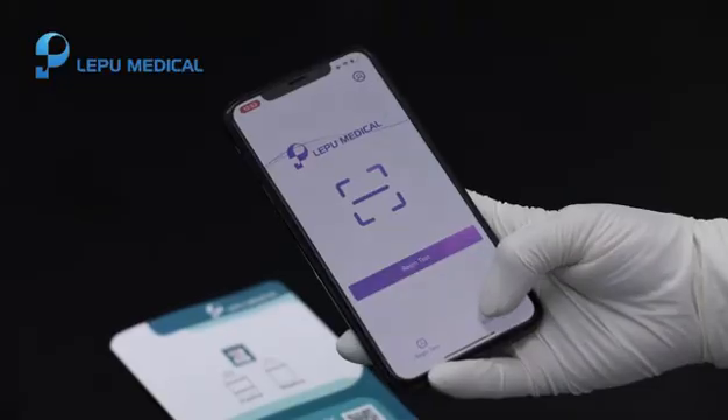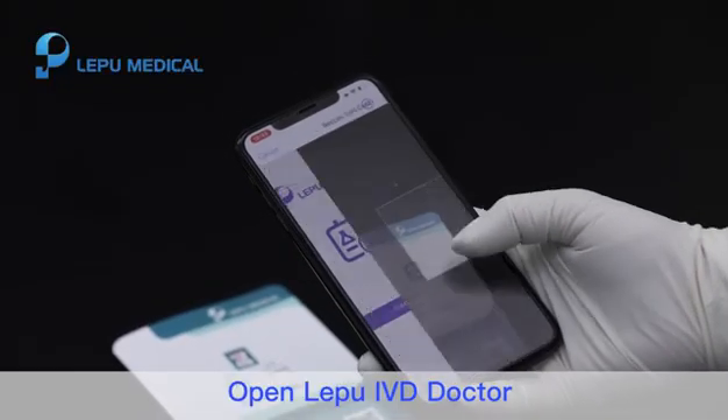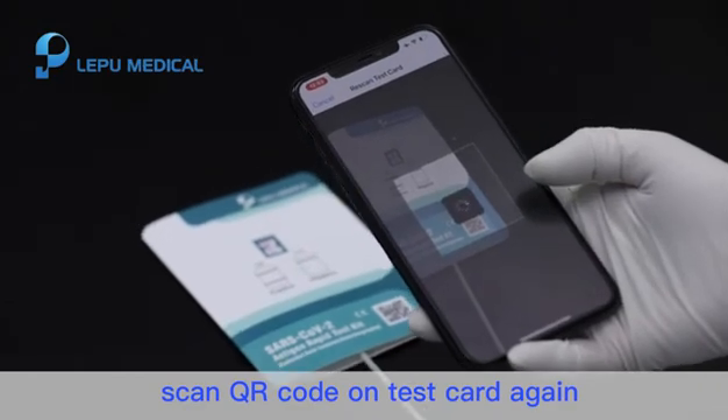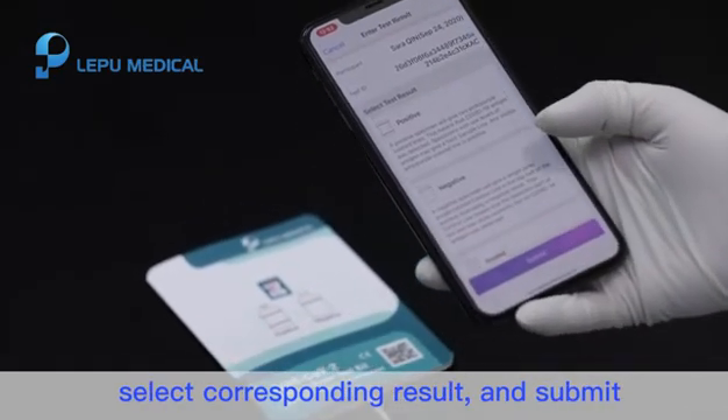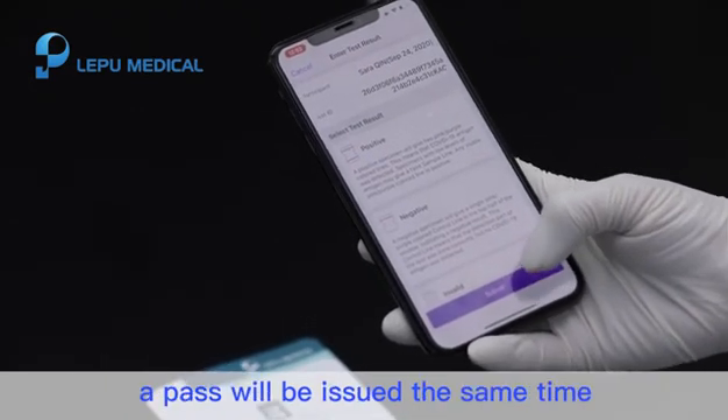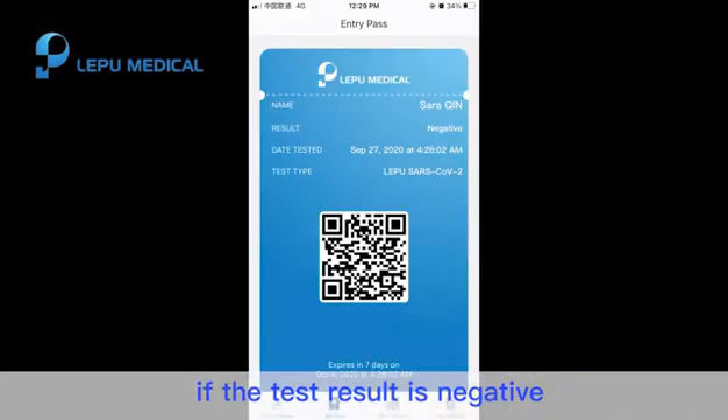Step 7. Open Le Pu IVD doctor and tap Enter Result. Scan the QR code on the test card again, select the corresponding result, and submit. The test result will be synced to My Result. A pass will be issued at the same time if the test result is negative. Check the expiration date and other details of your pass in Le Pu IVD My Pass.